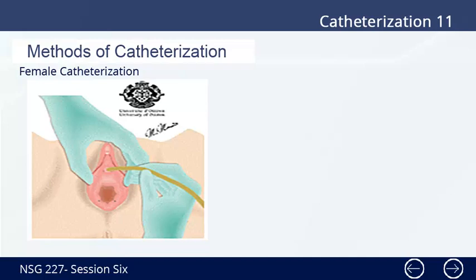16. Lubricate the tip of the catheter about 1 to 2 inches. Place drainage end of catheter in the collecting basin. Provides for ease of insertion of the catheter and reduces trauma to the tissues. 17. With the thumb and one finger of your non-dominant hand, spread the labia and identify the meatus.